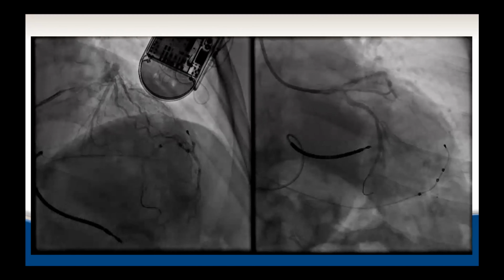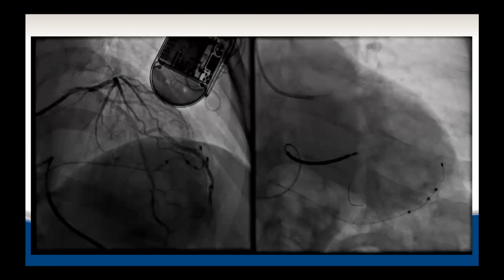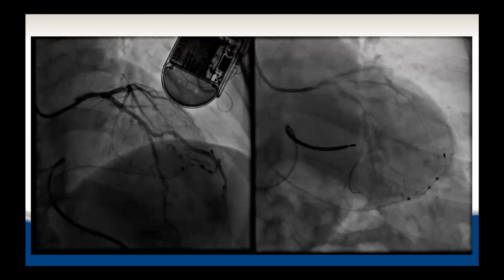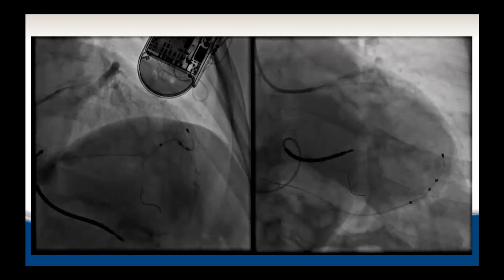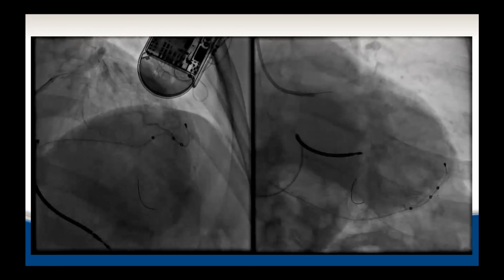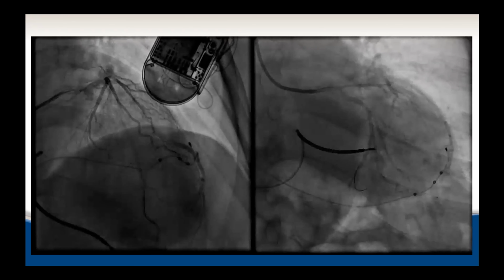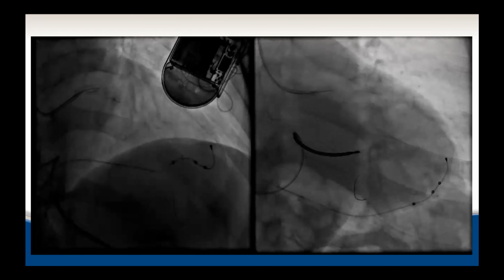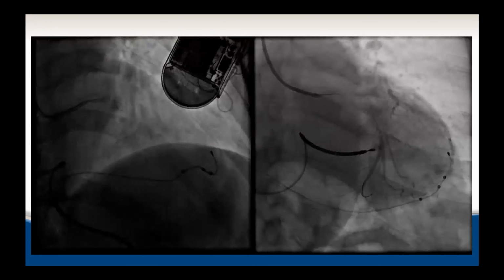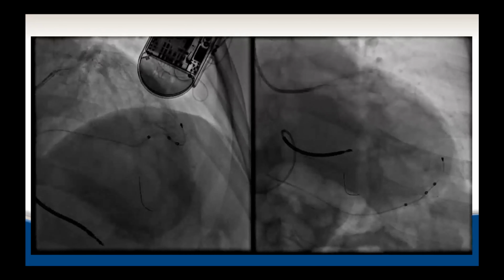I always thought CSI was better when you're dealing with that calcium on the inner curve. I know Akiko recently told me that based off their imaging that your wire bias is maybe similar, but I think you at least have a little bit more option in terms of if you can deliver the CSI and do it on the way back, you have more control there. So with those kinds of angles, I think it probably does give you an advantage, because it's not such a spiral vessel that you're getting straightening artifact and you're really worried about shredding it. Those you're just higher risk with really any device probably, but I think you guys do a lot of both. What's your take on that?